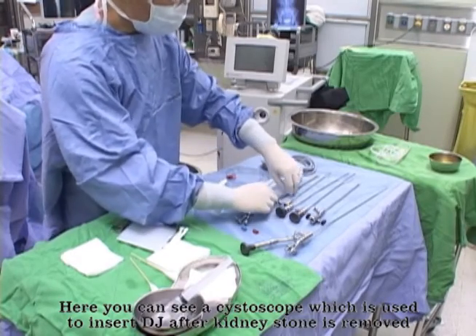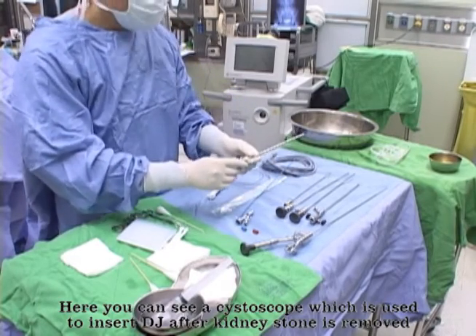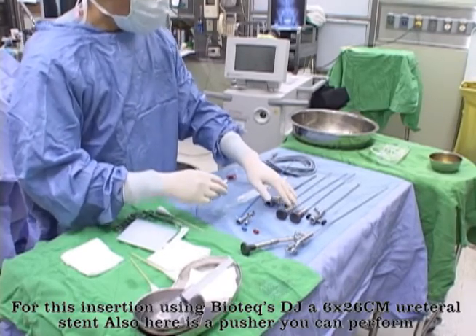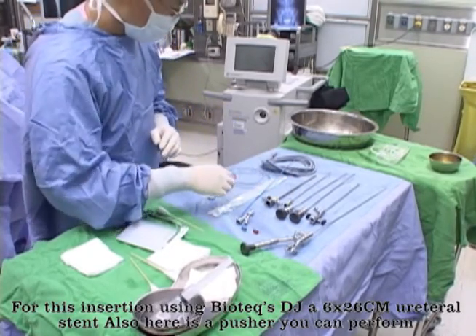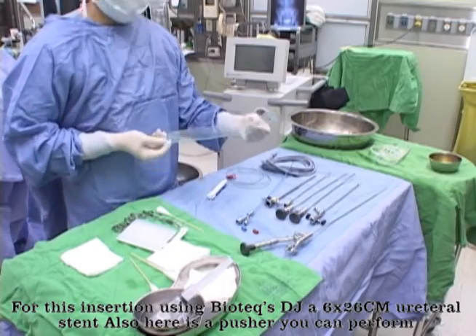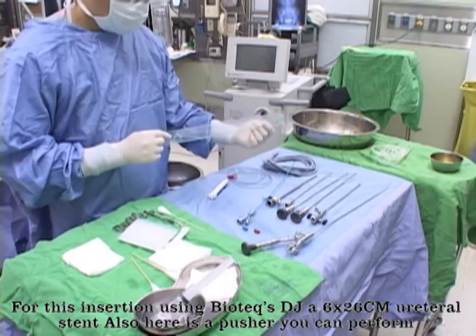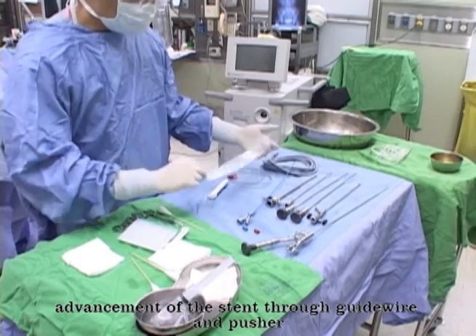Here you can see a cystoscope, which is used to insert a DJ stent after a kidney stone is removed. For this insertion, using a Biotex DJ, a 6 x 26 cm ureteral stent. Also, here is a pusher. You can perform advancement of the stent through the guide wire and pusher.